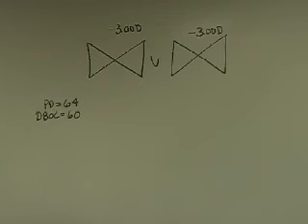Basic Optical Concepts, Unit 15, Demonstration Problem. In this unit, we're talking about induced prism when you're verifying a pair of glasses and you suspect and you know that the patient's PD and the DBOC, the distance between optical centers, do not match. And you have to determine whether that is within tolerance by how much horizontal prism that induces.